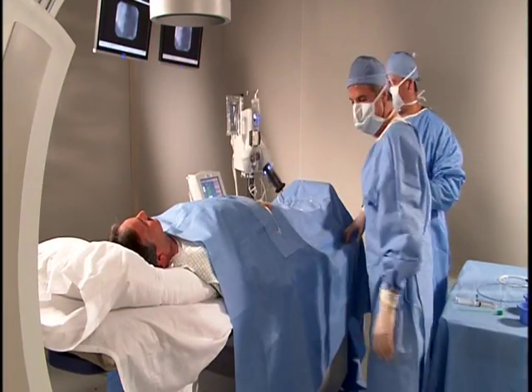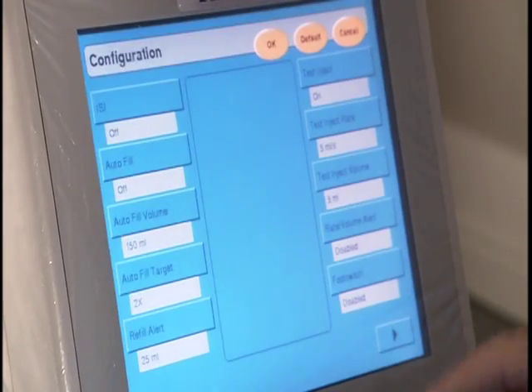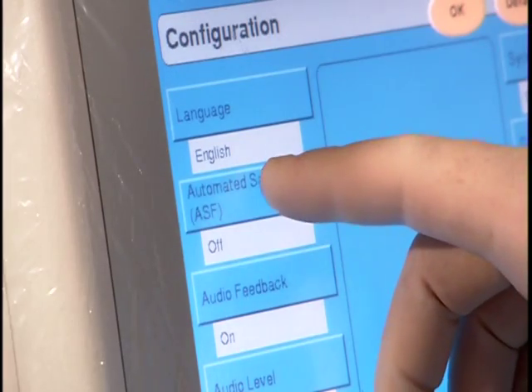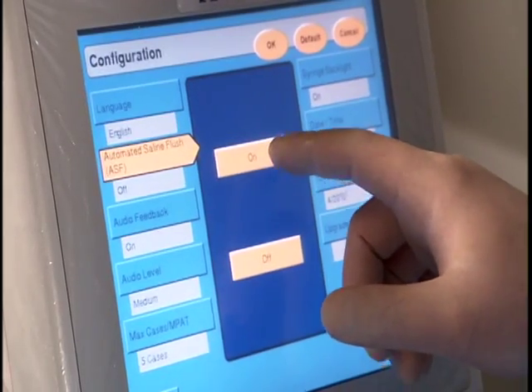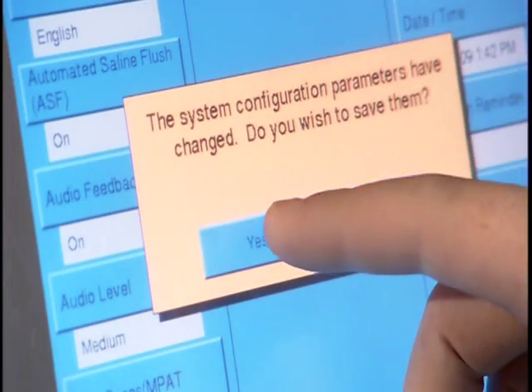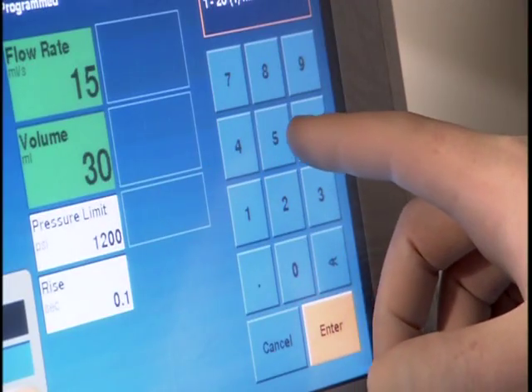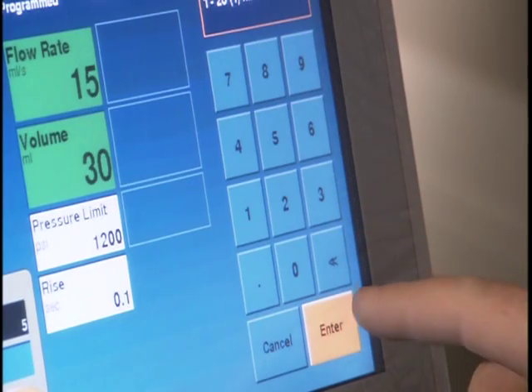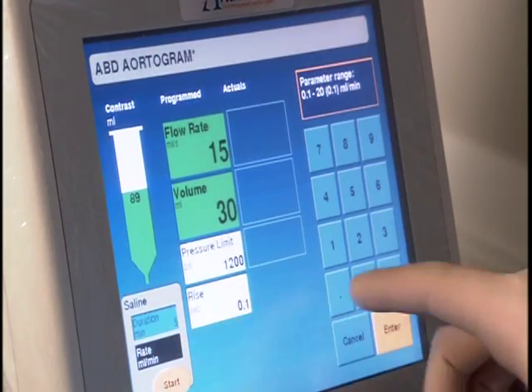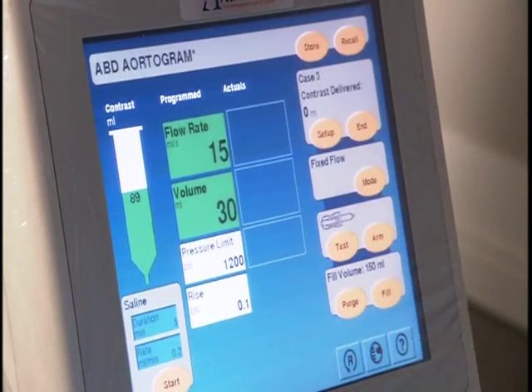Saline can also be delivered by activating an automated saline flush, or ASF, function on the main protocol screen. This feature can be turned on or off via the configuration screen. ASF can be programmed to deliver saline during idle periods when contrast is not being injected. The duration of saline delivery can be programmed from 1 to 20 minutes in 1-minute increments, and the delivery rate from 0.1 to 20 milliliters per minute in 0.1 milliliter per minute increments.